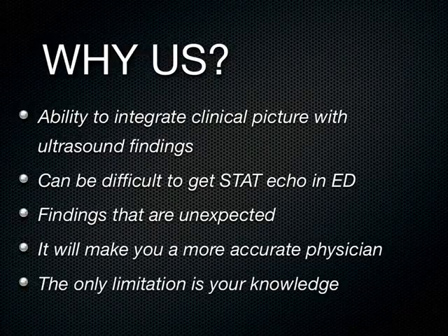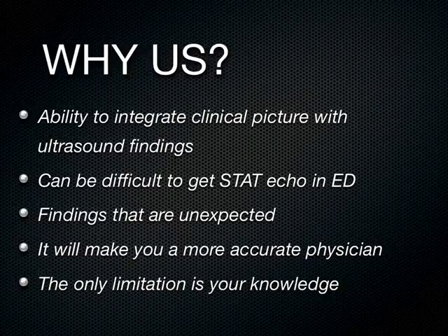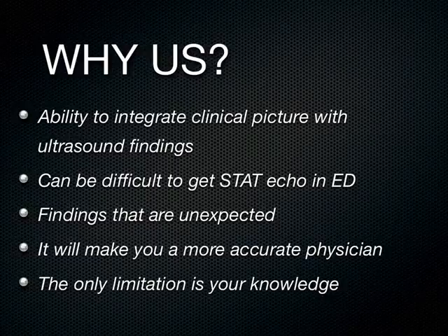We had a case of this just recently, in a patient who came in, was this 2 days ago? Yeah. Who had fatigue. I just reviewed it today during QA. The students were looking at the gallbladder and other structures, and there's a great ultrasound image of them looking at the gallbladder, but off in the distance towards the bottom of the screen, you can see a big fluid collection with the heart beating in it. Then they focused on the heart, and this was pericardial tamponade, and the patient went to the cath lab and had a pericardiocentesis done as a cure to their fatigue.